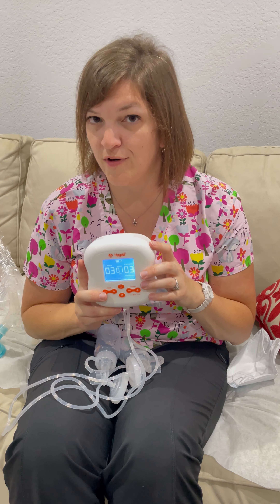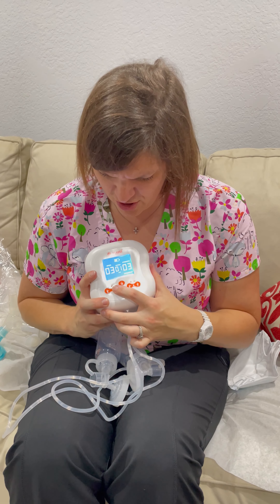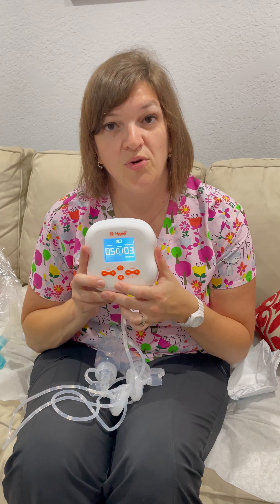Once your milk has transitioned to mature milk around day three, four, or five after birth, then you're going to want to have this speed at the top, which is a five. This is going to mimic a baby that has more mature mouth skills and is more efficient at moving milk. And you also want this suction strength comfortable.